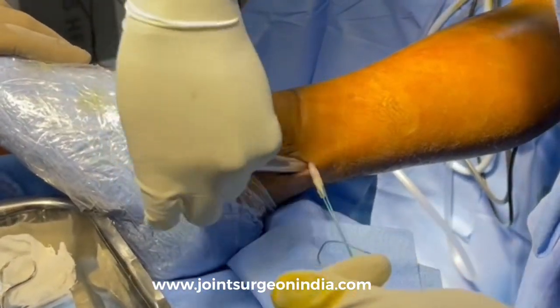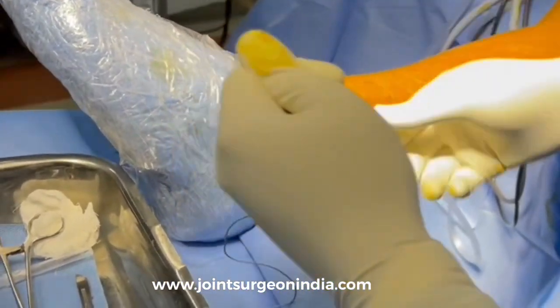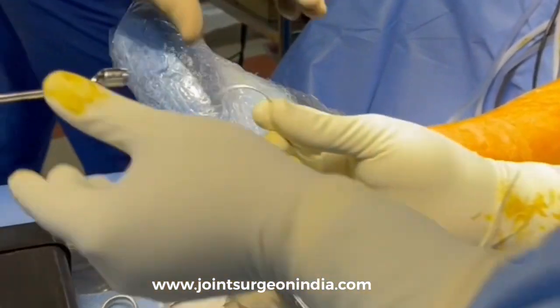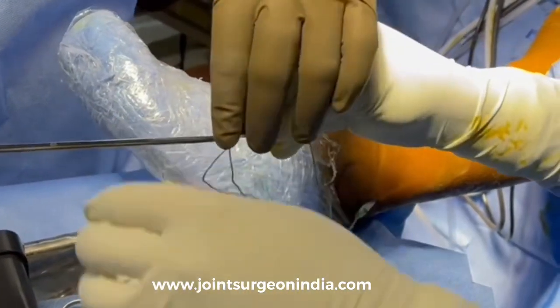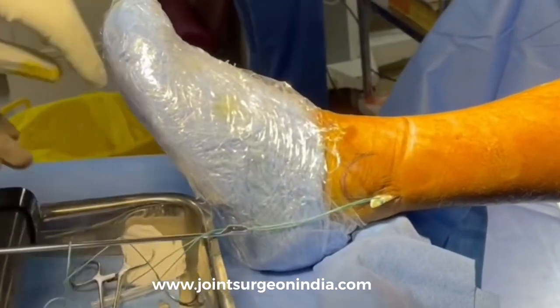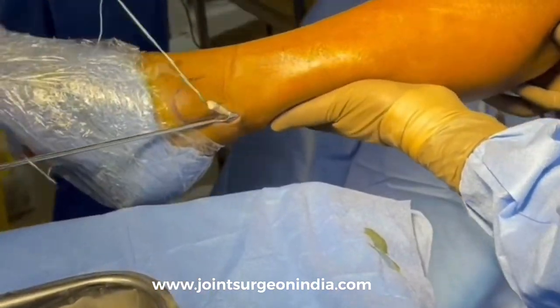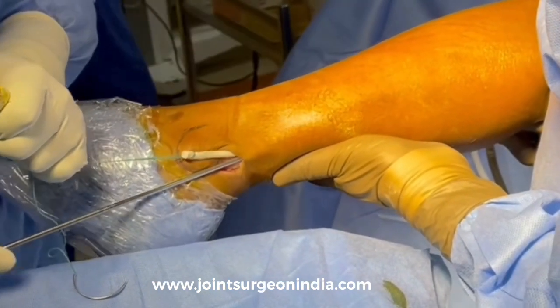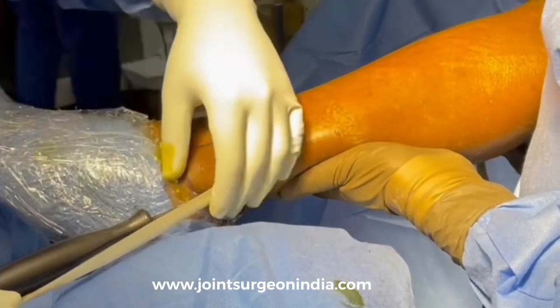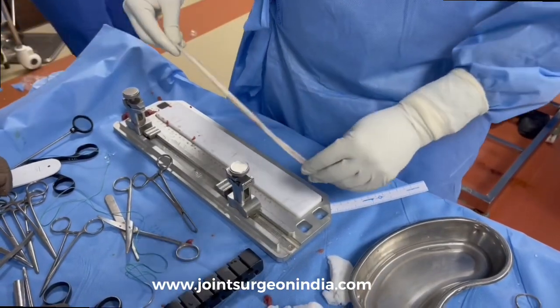After freeing up all the attachments around it with careful dissection, a tendon stripper is then used and the graft is harvested. Be very careful as you approach the neck of the fibula, where the chances of common peroneal nerve injury are a little high. The Peroneus longus has now been harvested and will be prepared on the graft table.